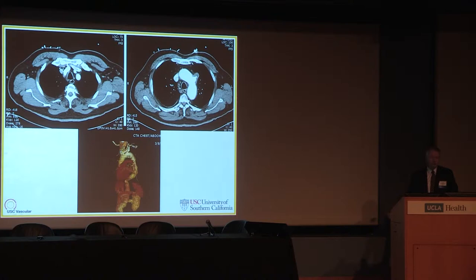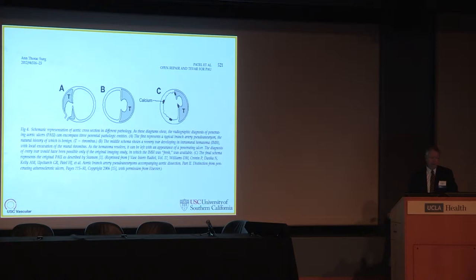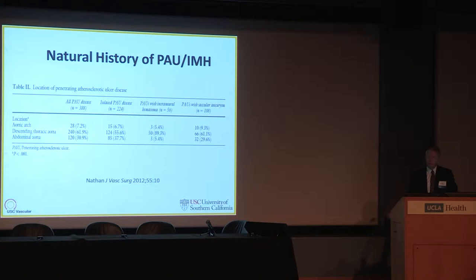This is a typical picture of a penetrating aortic ulcer with some surrounding hematoma. This CT or angiographic picture can actually occur in three different kinds of pathology: a pseudoaneurysm of a branch of the aorta, a recanalization of an existing thrombus, and an actual penetrating atherosclerotic ulcer into existing thrombus within the aortic wall. The ones with PAUs with intramural hematoma are more likely to be in the descending thoracic aorta by a large margin.